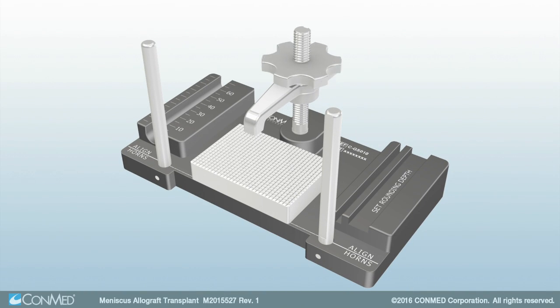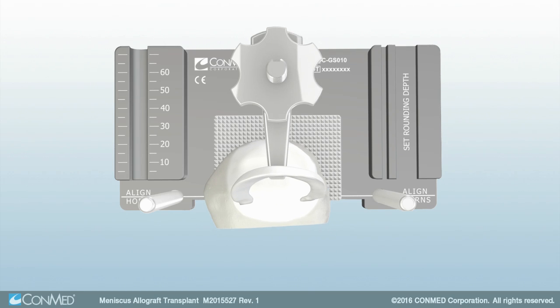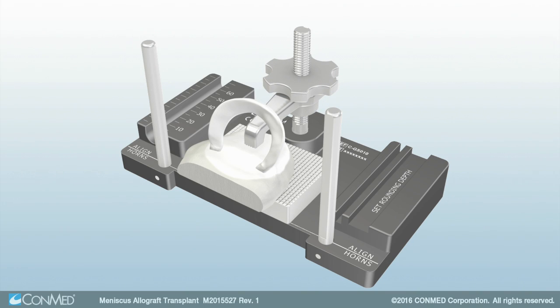To begin, detach the meniscus from the rim of the bone block and flip the meniscus over the clamp of the graft station. Align the midline insertion points of the meniscus horns with the laser-etched line on the graft station. Once aligned, secure the graft into place by tightening the graft station's clamp onto the tibial plateau.